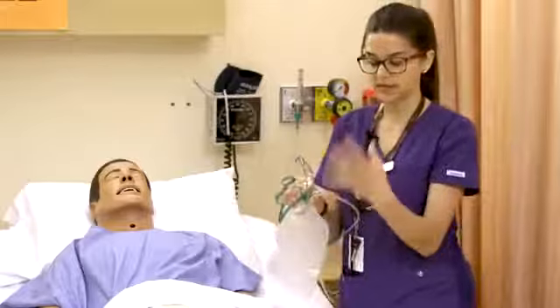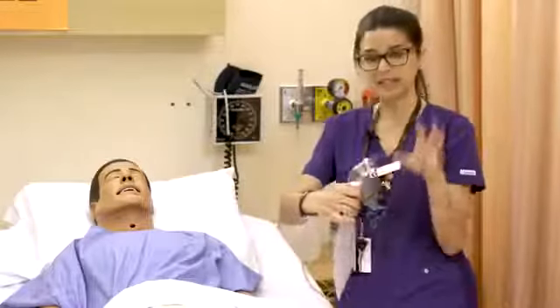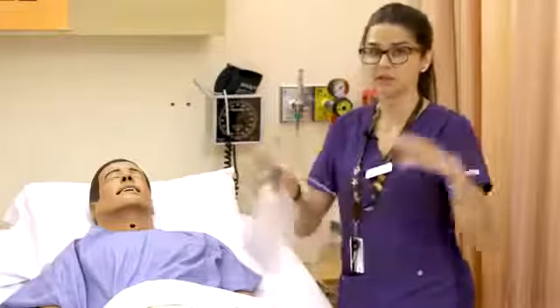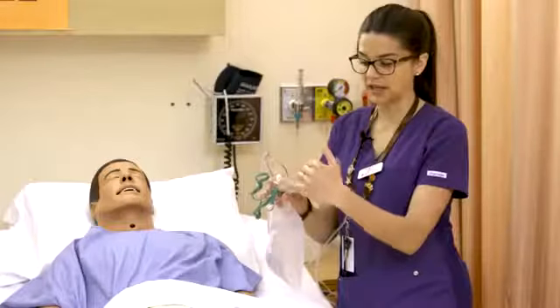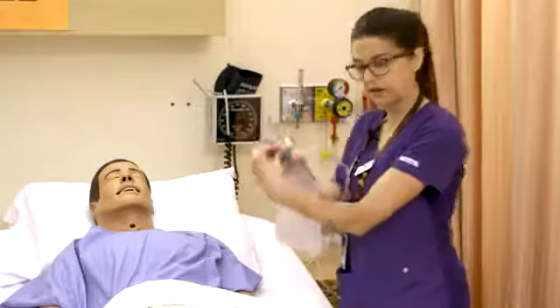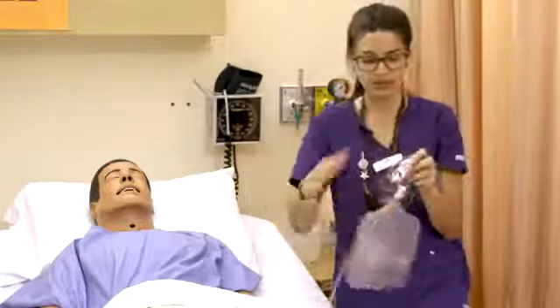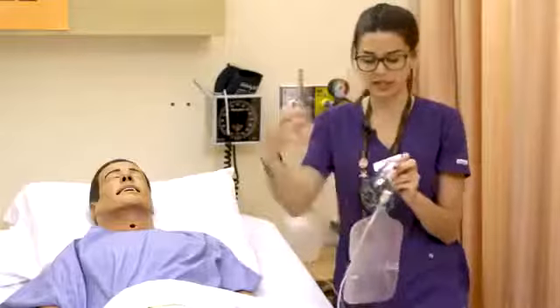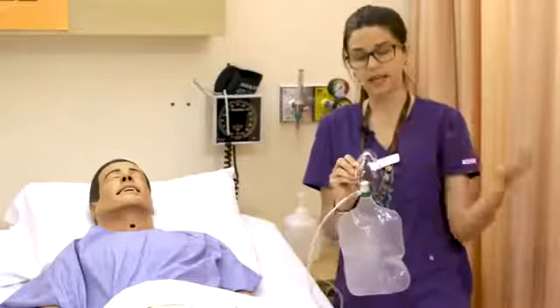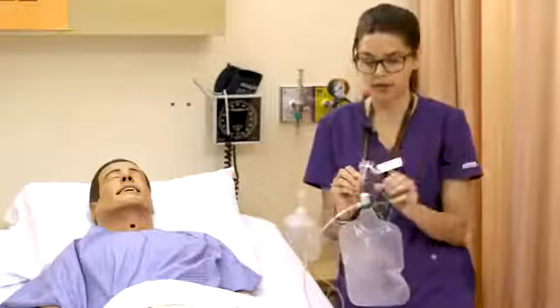This is going to limit, not completely eliminate, but limit the amount of room air that they inhale, because this again is a one-way valve that when they're breathing in, this valve closes shut, so they can't breathe in much room air. This one remains open, so they do get some room air, but this limits that.